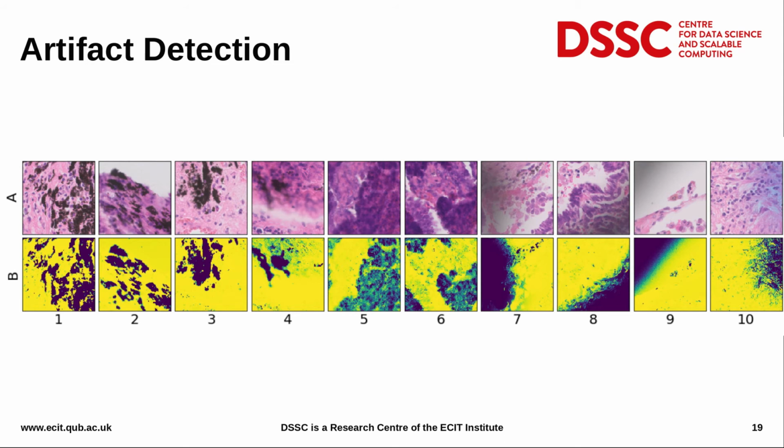We can visually see that our proposed model can detect a variety of artifacts. This information can be used to reduce the impact of artifacts on existing stain separation methods.